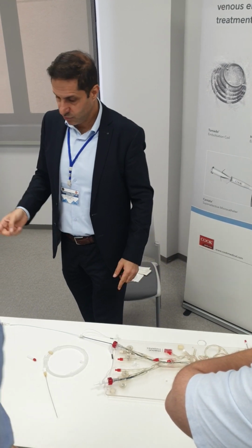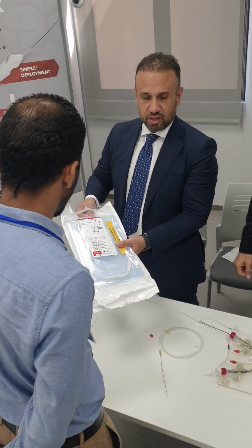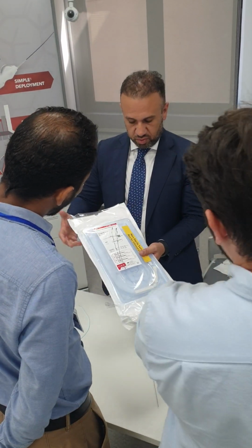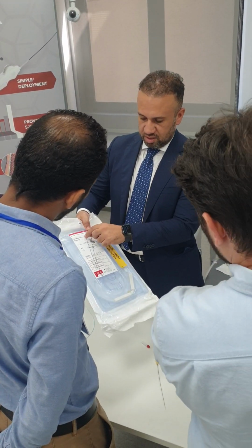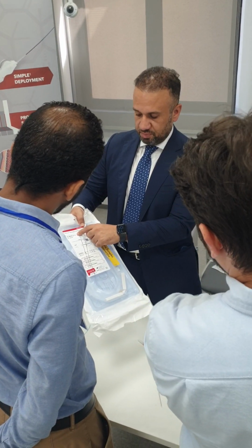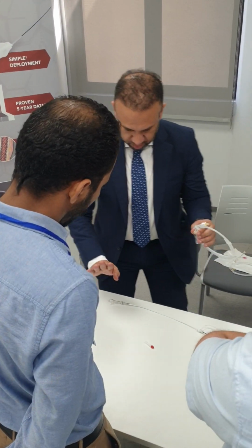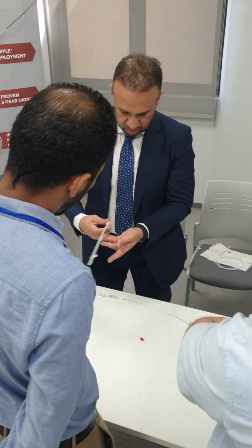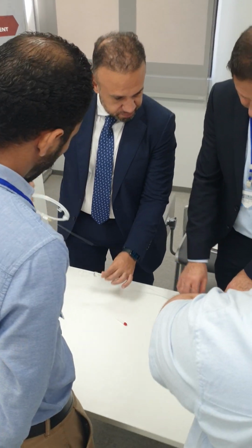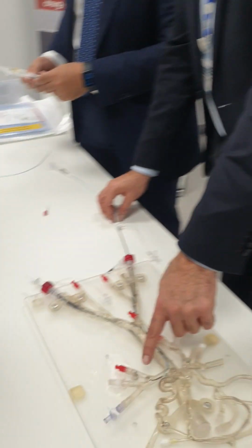So we are now demonstrating. This is a detachable coil called retractor, coming in an 035 system. Here you can see the label with the diameter and the length. This is 4 mm diameter and 7 centimeter length. I will guide you through the deployment. We just want to put this cartridge in the hub of the catheter. They have already a supporting catheter or sheath in place, and this is your target vessel.